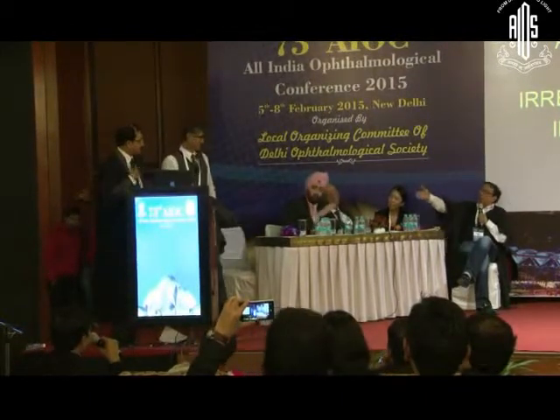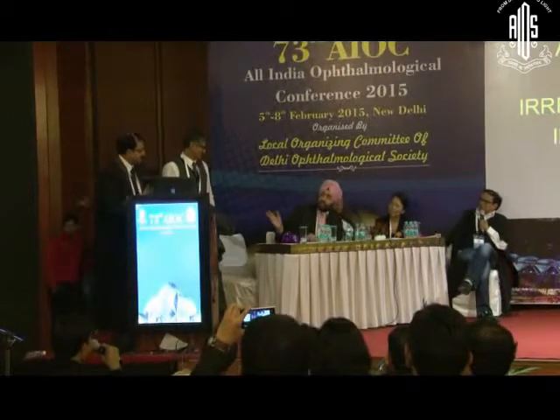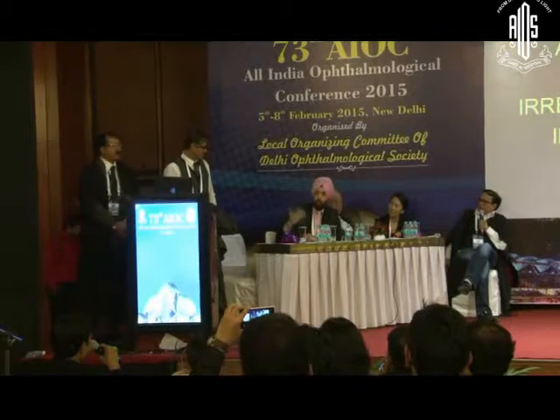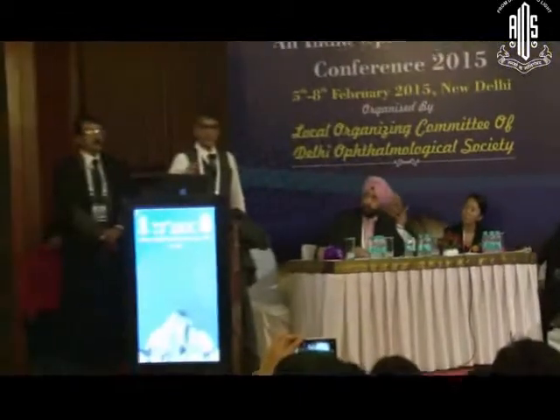Center for Sight, sir. Basically, you are trying to do a piggyback with an ICL, right? Yes. So, if you had put an intraocular lens and then waited for the calculation, what are the basis of the calculation that you had for this? If you want to put a secondary IOL, then you can do it in the primary position, a piggyback. If you want to put an ICL, then you remove the cataract, put an IOL, do the post-operative refraction, and then select an ICL, and then you can put it.